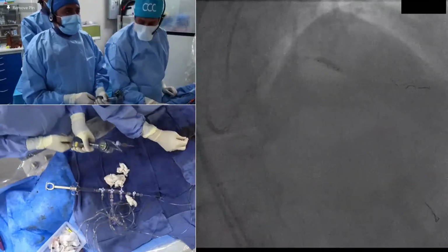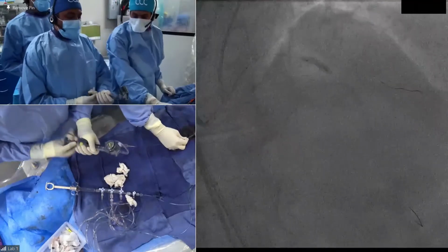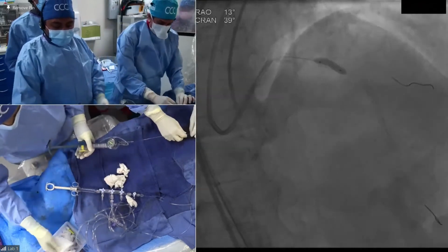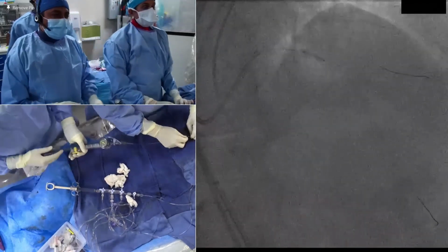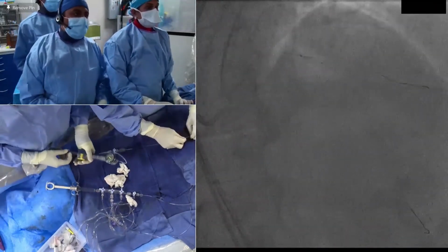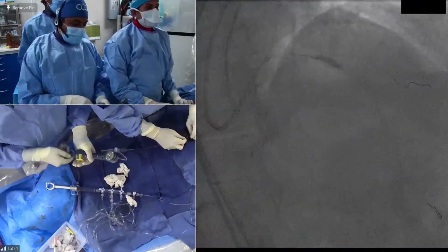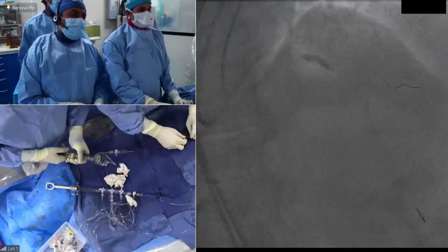Jason? 16, 18, 20. Matu? I'd cut the diag and stent across. So the majority is we cut the diagonal, and the strong minority position that includes Dr. Fox and Dr. Kini, apparently, is ballooning the LAD and seeing what happens with the diagonal. So let's see about that.